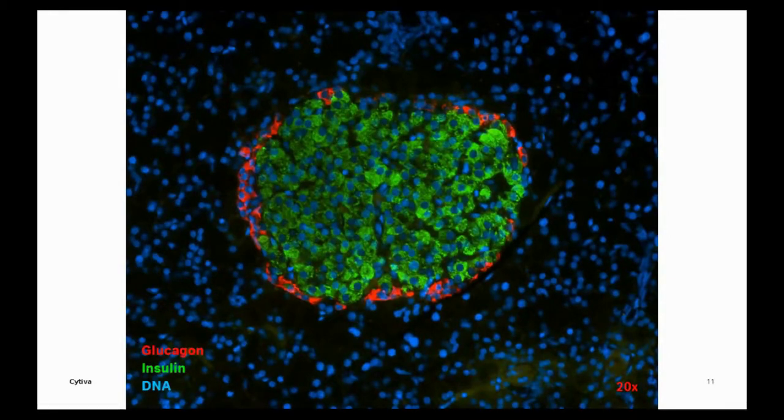So here on the right, we have rat islets from the pancreas. In blue, we see the nuclei of these cells. And then we see staining in red, which is glucagon in the alpha cells that surround the islet. And then we see staining in green, which is against insulin, which identifies the beta cells within the islet.